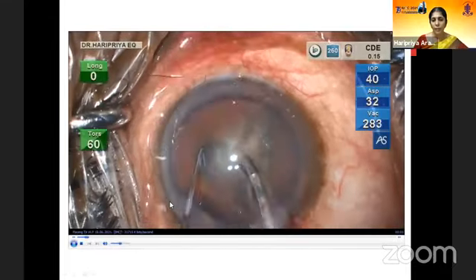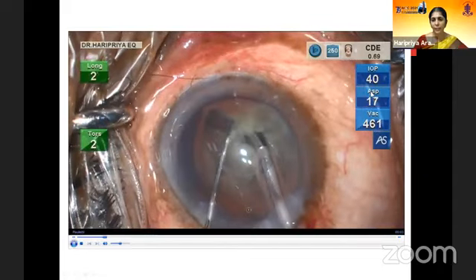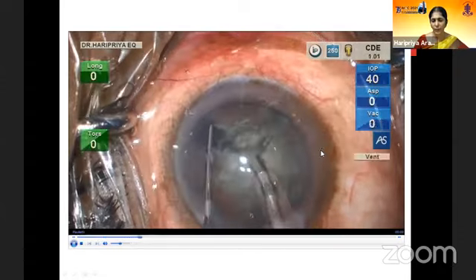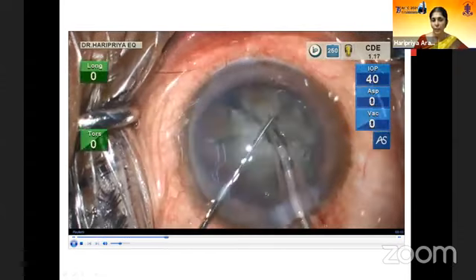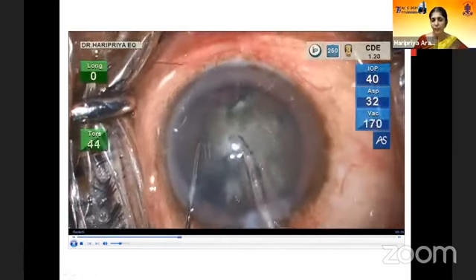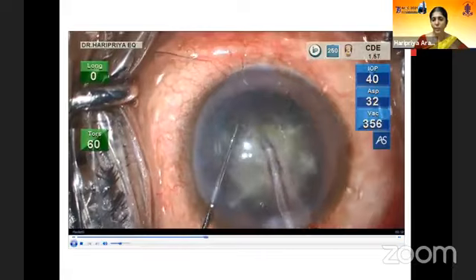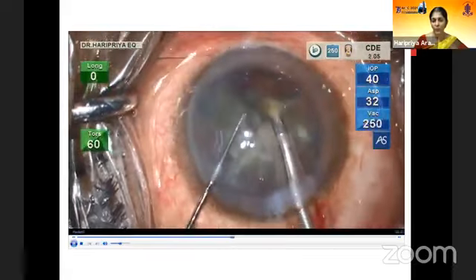So this is an immature cataract, slightly on the harder side, with the Active Sentry. The IOP here is set at 40. For a similar grade before the Active Sentry, my standard IOP would be 60 with about 20 leakage compensation, which would mean more than 60 in actual surgery. So here when I have a lower IOP, it means so much more comfort for the patient.